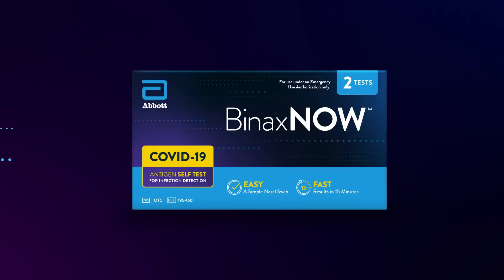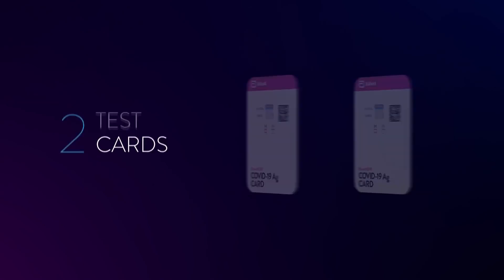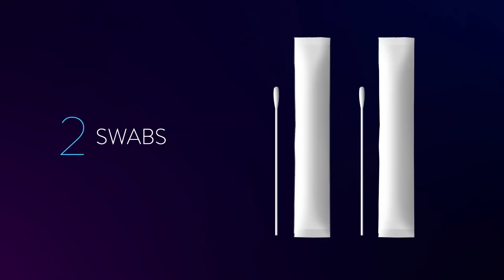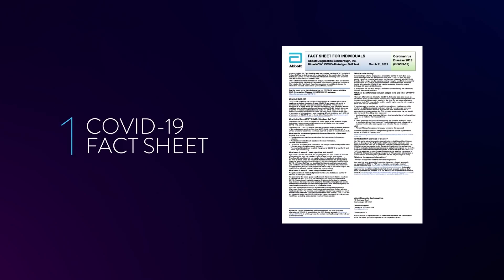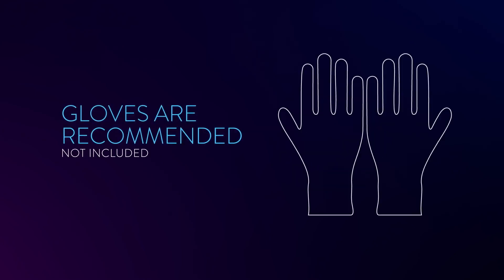In the box, you'll find two test cards, two dropper bottles, two swabs, an instruction sheet, and a COVID-19 fact sheet. You will also need a timer, which is not included with the test. Gloves are also recommended during the test, but are not included.